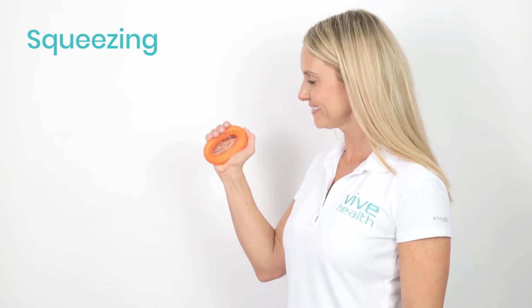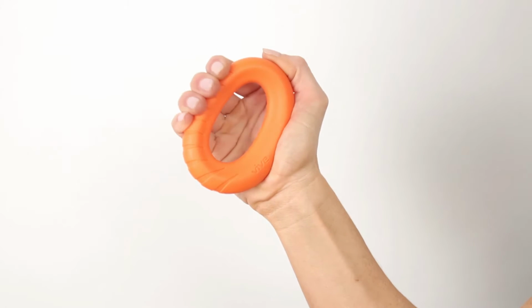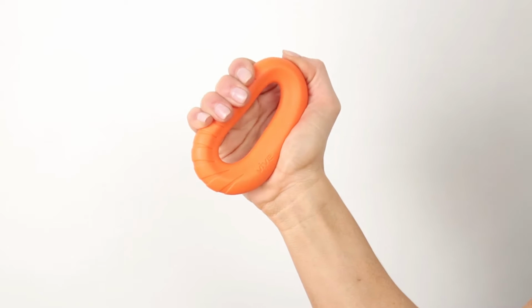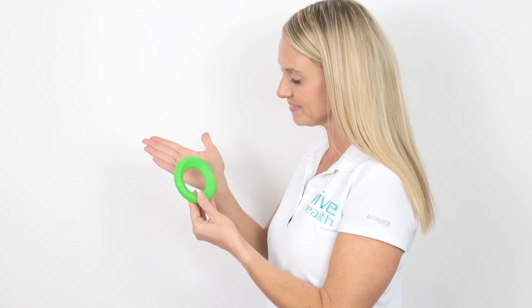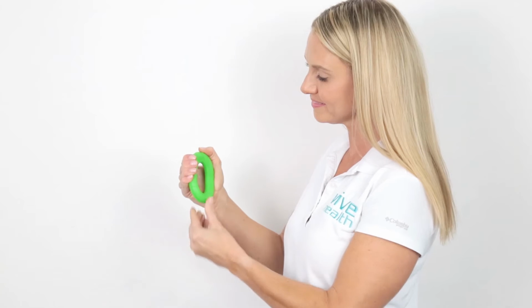Squeezing. With the new ergonomic style, you can now try two methods. Squeeze with the ring between the middle of your fingertips and the palm of your hand on the rounded sides, like a normal ring grip. Or try it with the flat part of the grip resting deep in your palm.